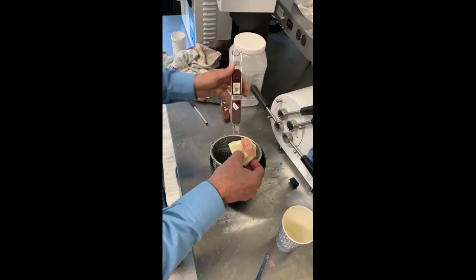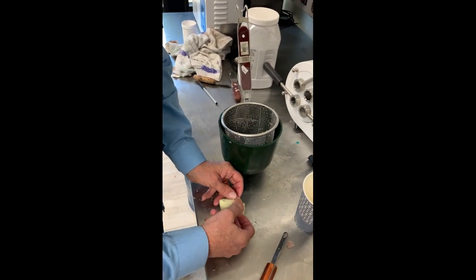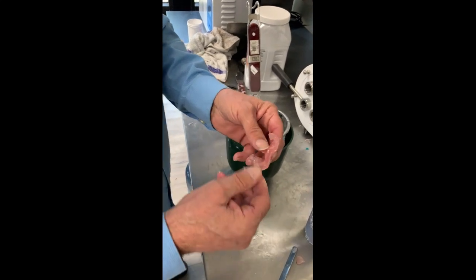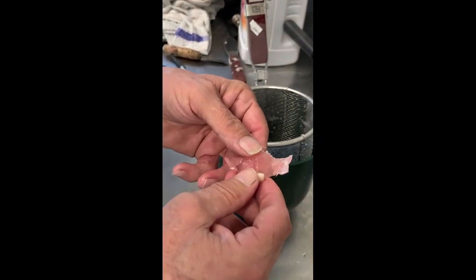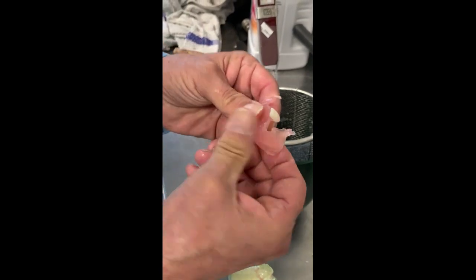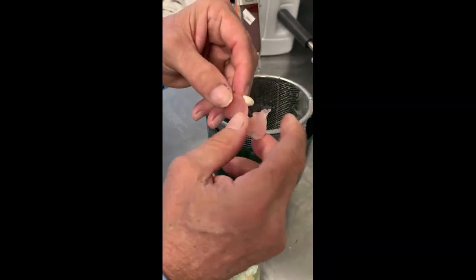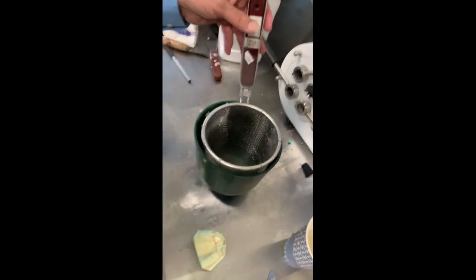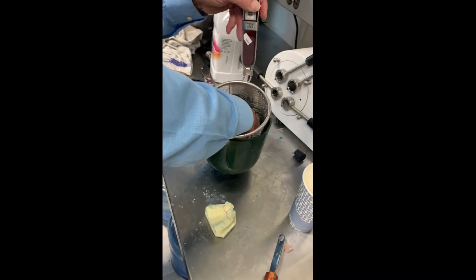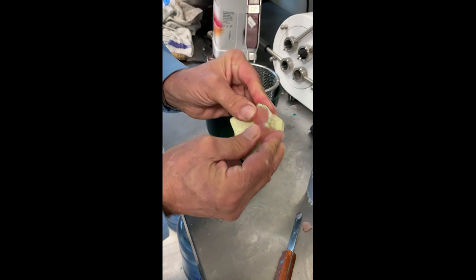Go ahead, and this is why I was saying you don't need a duplicate model, but this should come right off the model, just like that. And you can see now, it's much easier to know where to trim down. And while it's hot, you can bend the clasp in and out. And the thinner the pellet is, you'll be able to move it around. I'll show you a little bit here of how flexible this can be. Just like that. And once it goes back on the model and cools down, it'll get hard like acrylic.